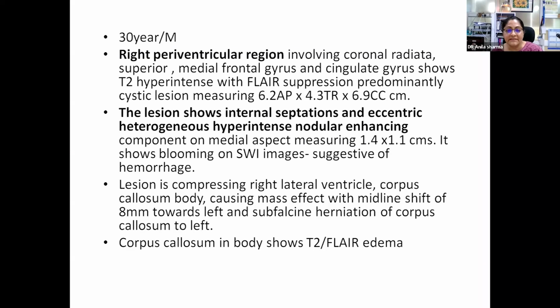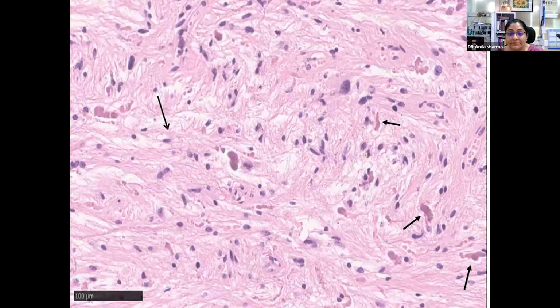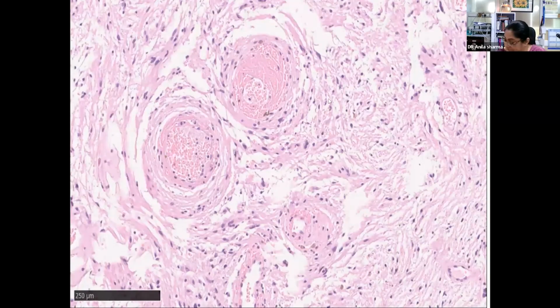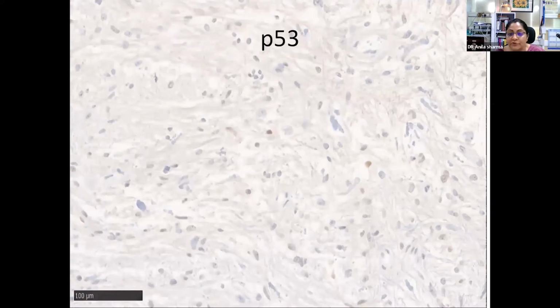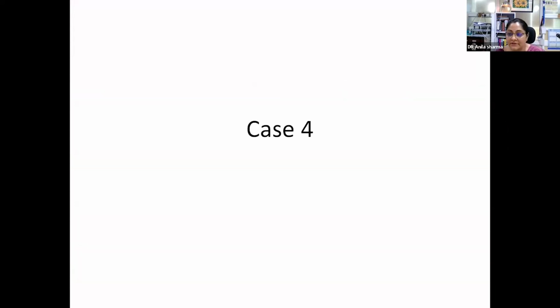Okay, so this is also pilocytic, and this is another case, a tumor in the periventricular region, and if you read the radiology, it looks as if it is a very high-grade tumor. It's going everywhere, it seems. But when you see the morphology, this is actually a pilocyte, a cell which has hair-like processes. I think ma'am will agree here. This is showing nicely, and these are cells that are a little compact and around the vessels. These are the EGBs, and these are the Rosenthal fibers. They are carrot red in color usually. And these are the concentric vessels. P53 is also very low in pilocytic. Usually it is not seen. ATRX is retained. Ki-67 is just 1 to 2% again. So this was also a pilocytic astrocytoma.